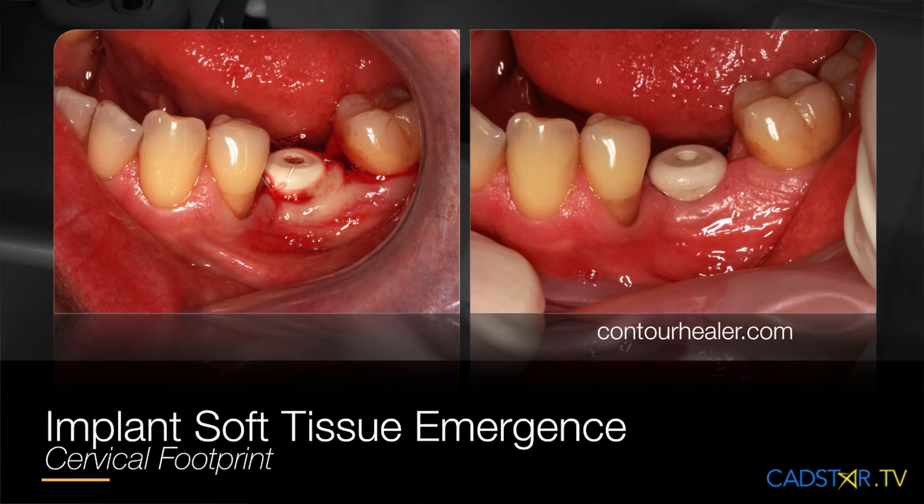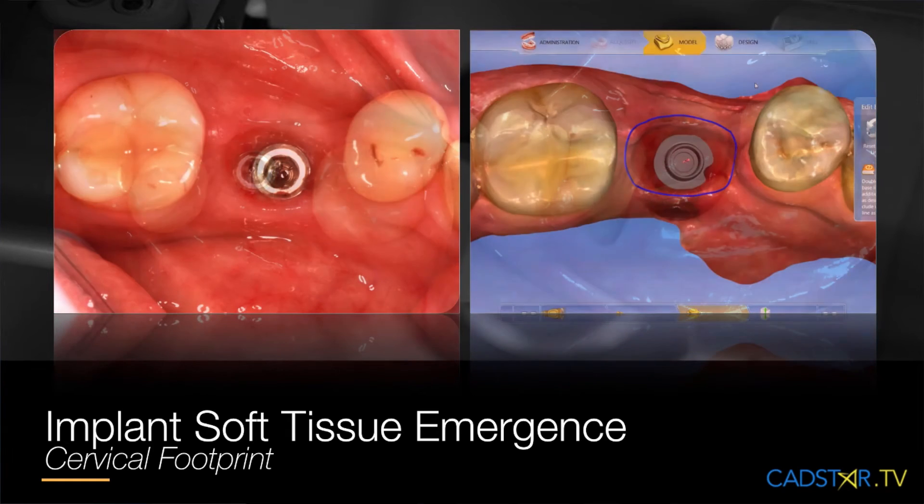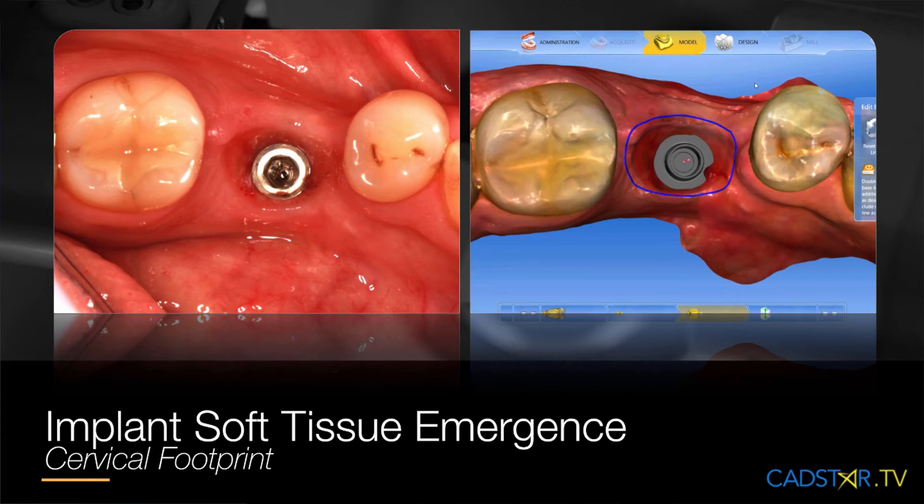This healing cap is actually from contourhealer.com. I got this idea from Dr. Oliveira. They really work nice. As you can see, the sulcus and the emergence is really well formed.